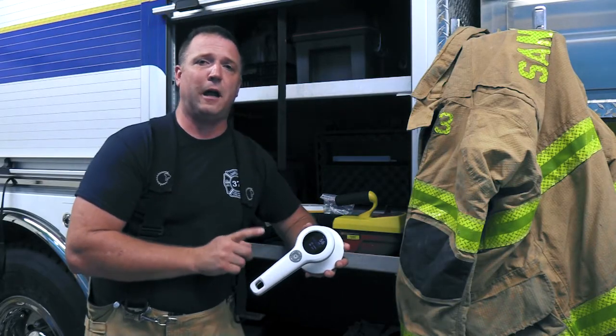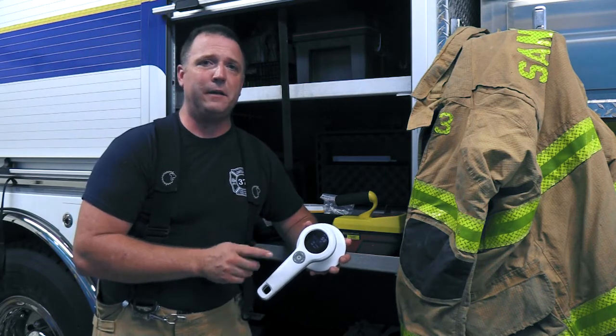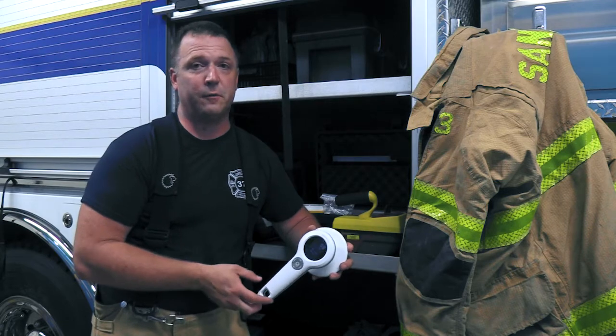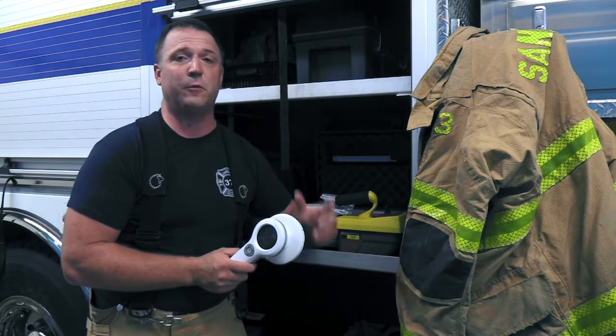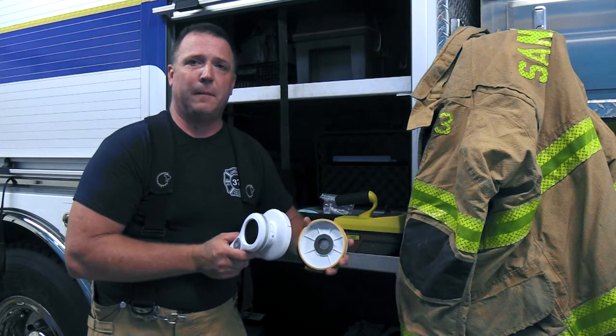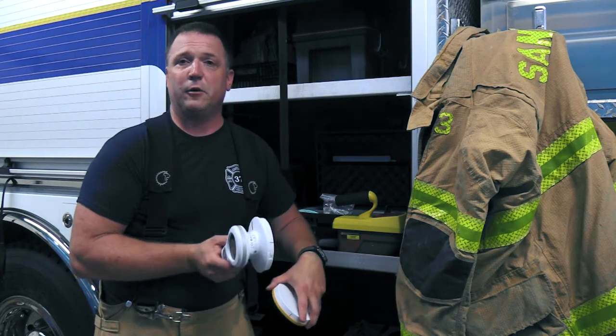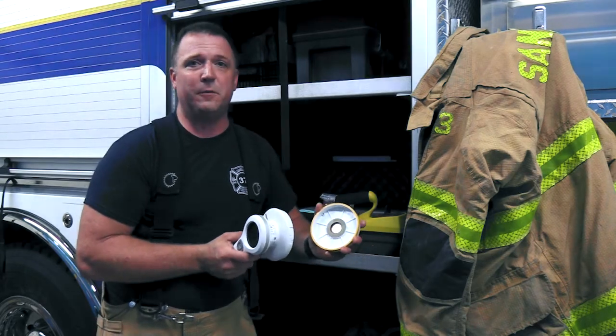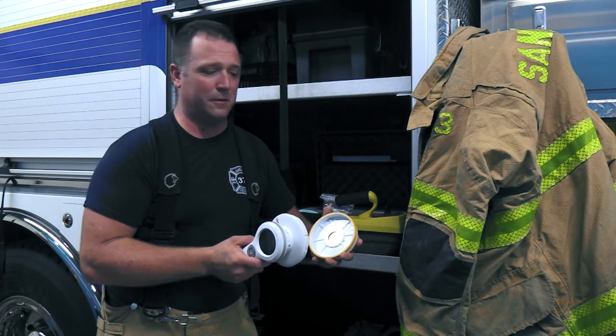The 452 also carries an IP64 rating, meaning it's able to be used in a dusty as well as wet environment. It's going to survive as we walk through a rainstorm. The 452 comes with two different filter caps, both an ambient as well as an air kerma cap, meaning that we can read in Röntgens, Sieverts, Grays, or whatever designation you might need for your application.